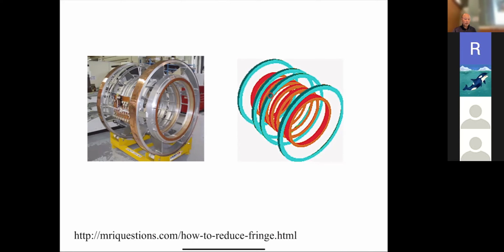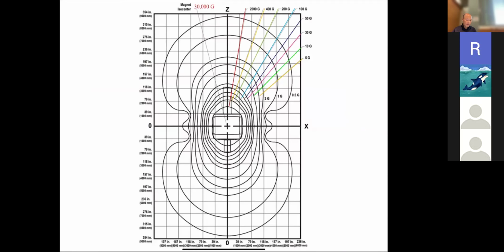So there are two things that we do. One is we have a counterwound cable. If these cables were wound this way, these cables will be wound the other way. So they basically cancel out the magnetic field, do their best to cancel out what's called the stray magnetic field, right? For every magnet you get, you have these plots of magnetic field lines.